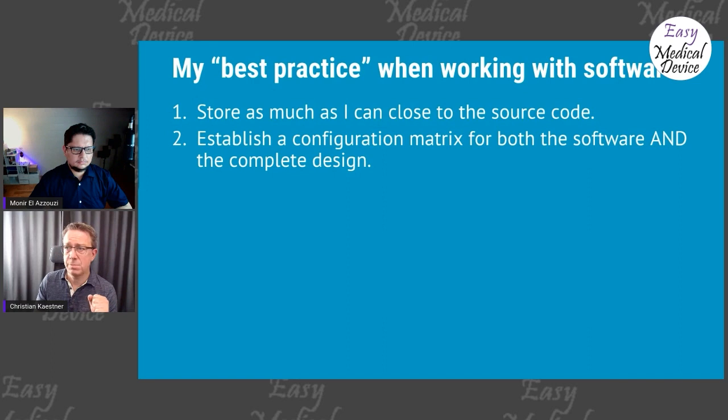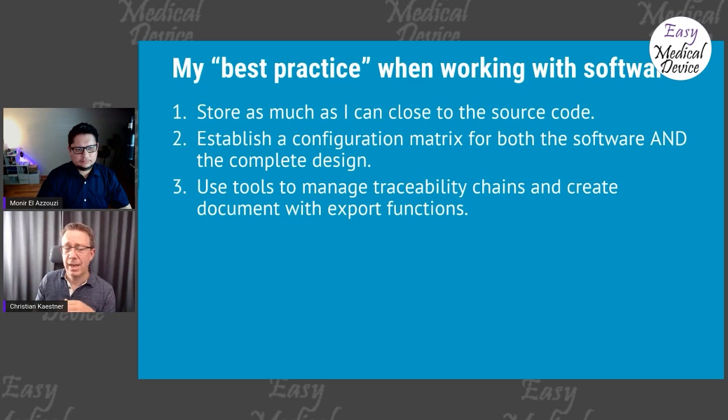It's still documented. I do establish a configuration matrix for both software and the complete design, and that ties back again to Elkin's questions before, I guess. I definitely use a tool to manage traceability and change, and create documents with an export function when needed. I'm, again, super lazy. I spend time setting up the system and trying to let the system work for me.